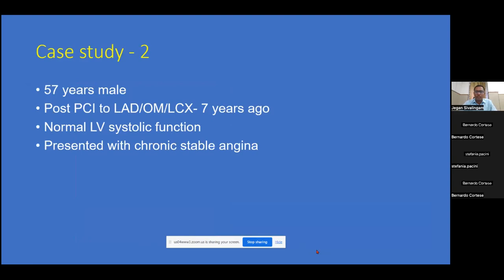In this case, it is mandatory to use imaging. So it was absolutely correct to use IVUS or OCT, whatever you want, but you have to understand how the calcium is, and according to that, decide which treatment to use. And then in the end, you can decide to place stents like you did, and then you have to assess in the end if the stents are well opposed and well expanded.